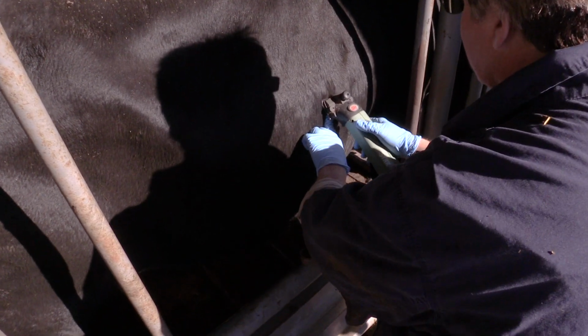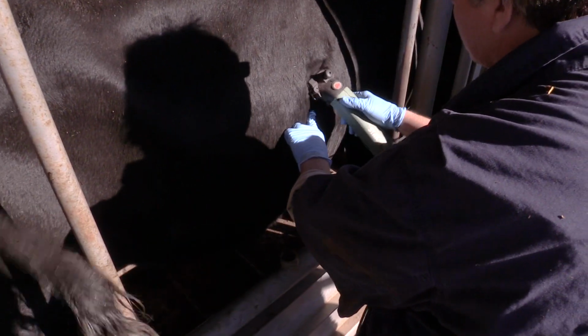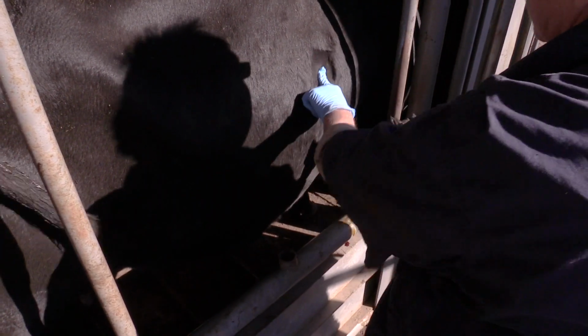Clip the hair at least 2 to 4 inches from center of the landmark with a number 40 or number 10 clipper blades. Inject 5 to 10 ml of lidocaine subcutaneously and intramuscularly with an 18-gauge 1-inch needle approximately an inch surrounding the biopsy location. Allow at least 5 minutes prior to biopsy after the lidocaine injection before starting the biopsy procedure.